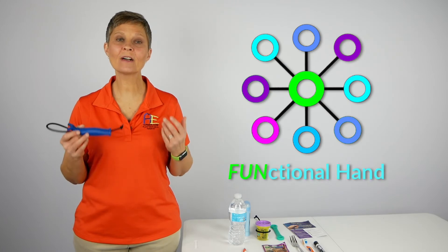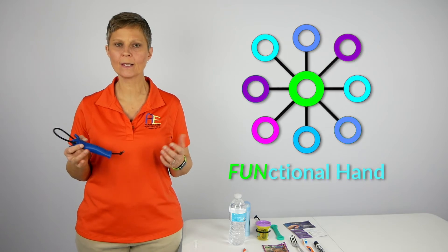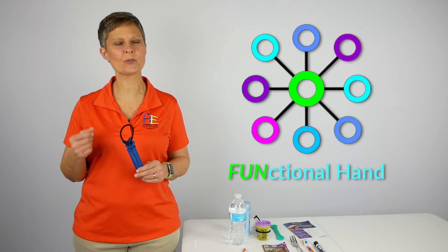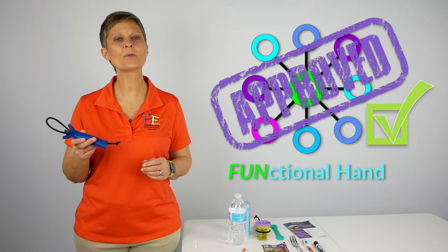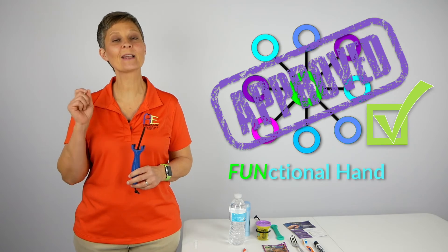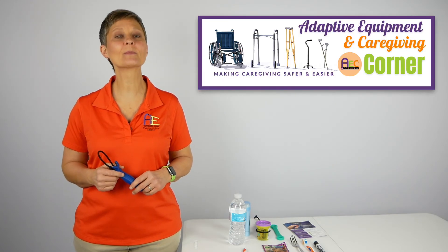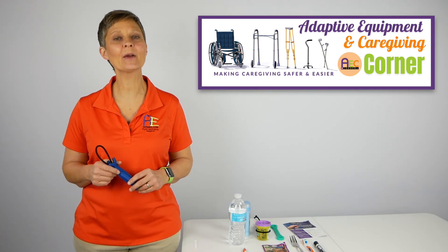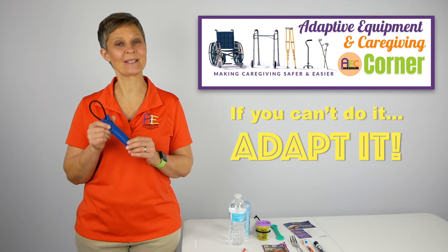In summary, the Functional Hand can be used by individuals from a wide range of ages and abilities. It may be slightly limited depending on the material, size, and weight of the object you're trying to hold, but all in all, we would certainly recommend the Functional Hand for those individuals struggling with grasp, in order to help with both functional and fun activities. Be sure to check out the comment section below for links and additional information. That's it for today from Adaptive Equipment and Caregiving Corner. Have a great day, and don't forget — if you can't do it, adapt it.